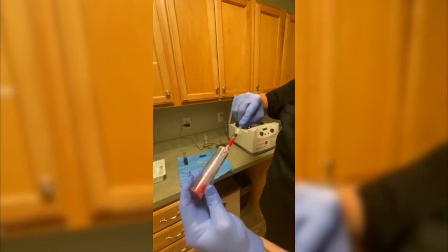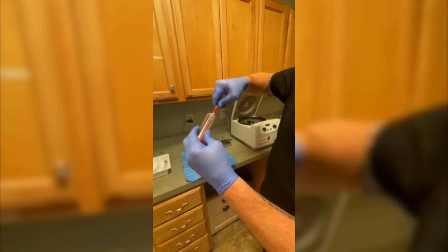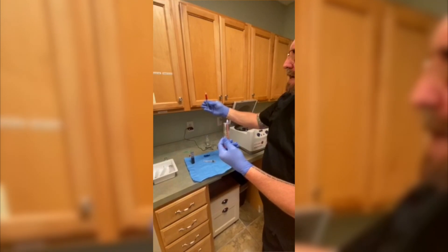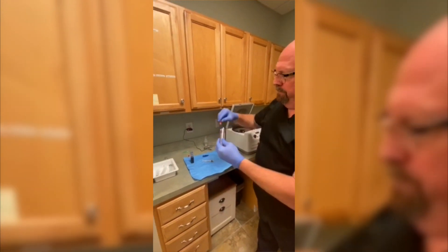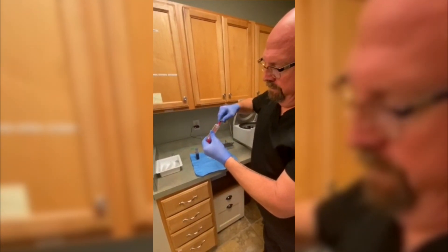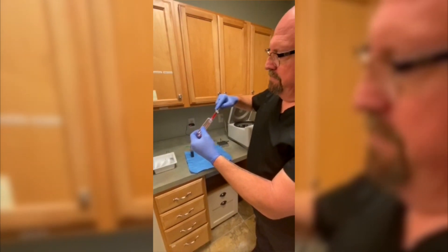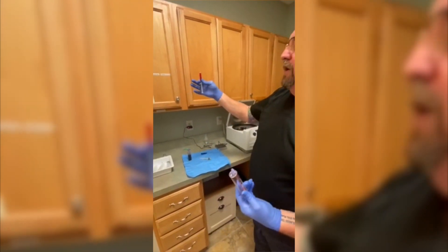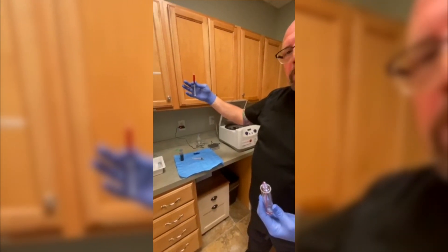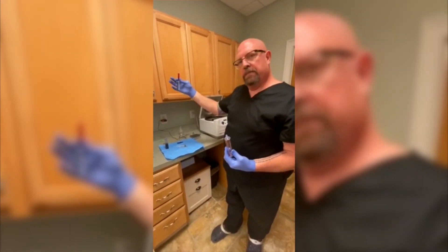I take another syringe, hook it onto the top, and pull off the PRP we're going to use for the procedure. You have to tilt it to the side — there's a little crook in the bottom of the container, and that's how you get your PRP. Push the air out and get the remainder of the PRP out of the tube. We now have PRP that's about five to six times concentration of whole blood, with all your platelets, growth factors, and cytokines for the procedure.